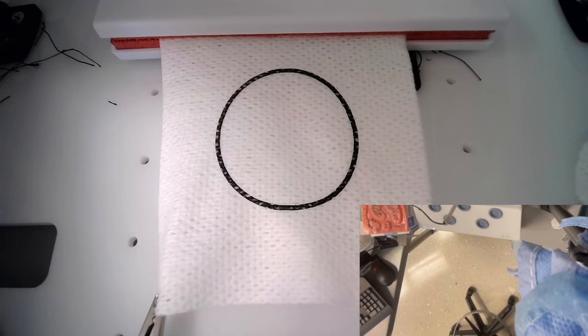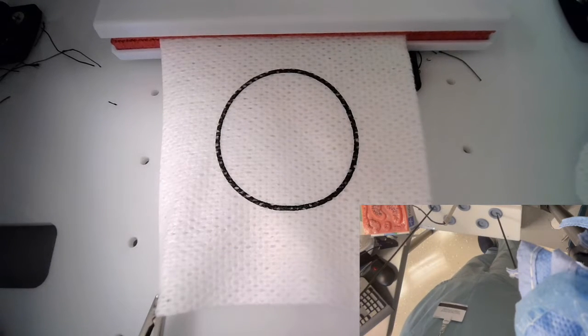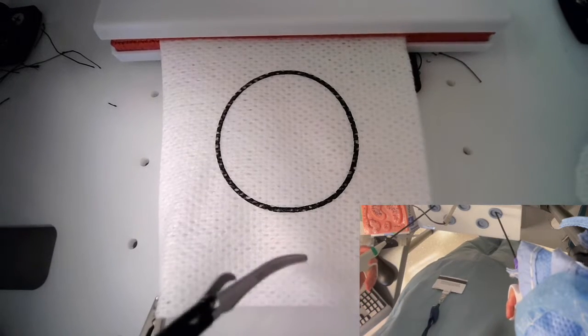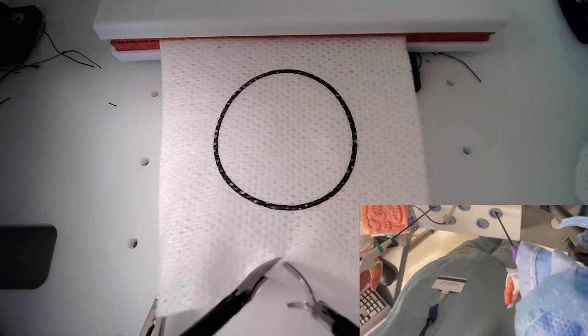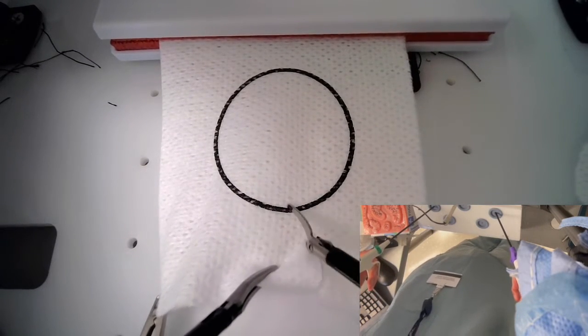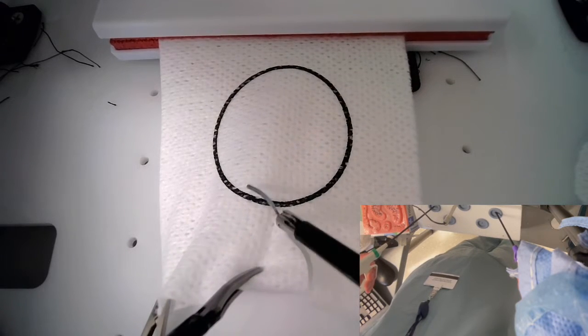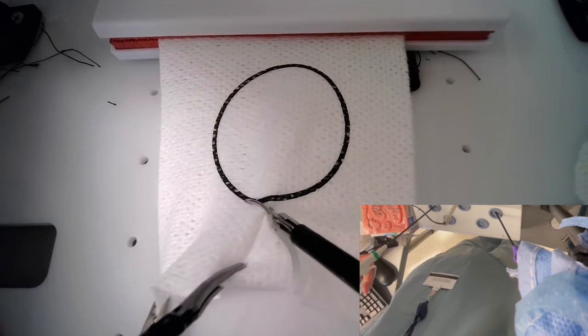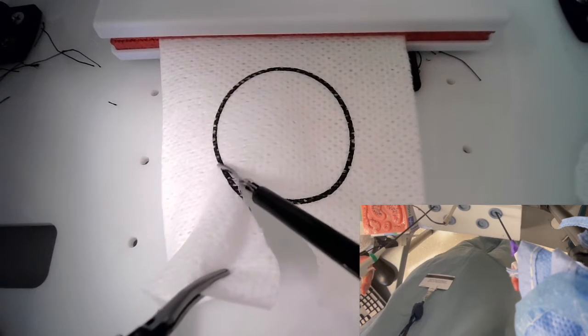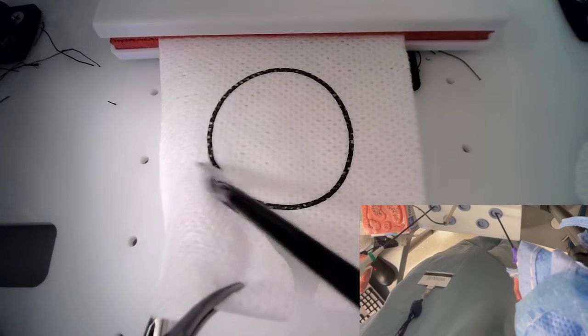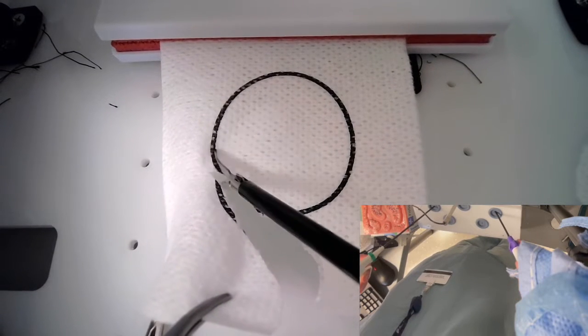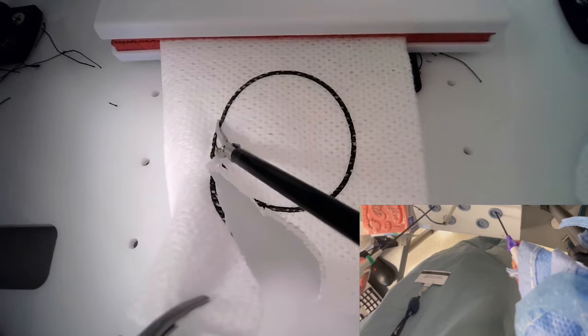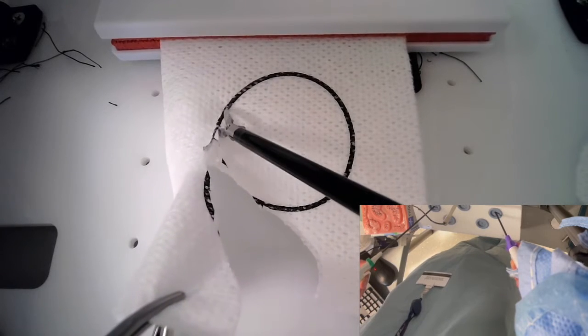Hello everyone, this is a short video tutorial on the precision cutting exercise of the FLS. To be successful in this exercise, you will need to hold the gauze taut, and one modification that I particularly like is to exchange between your right and left hands, which is not advertised enough in my opinion.